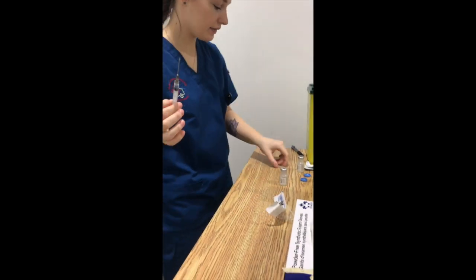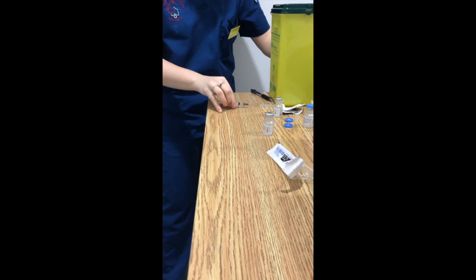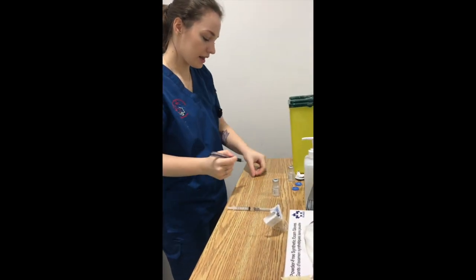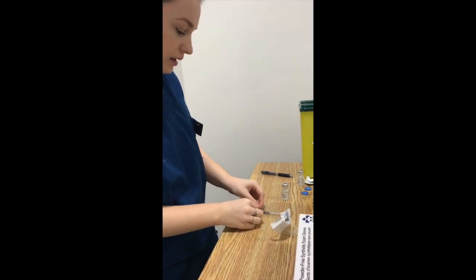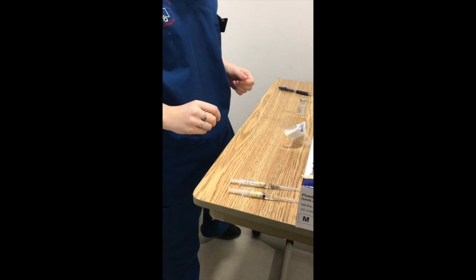Again, following the safe needle technique, we're going to push up against the container to keep our hands out of the way, and then it's capped. And then we're going to write another little label for the Haldol, and then we're essentially ready to go.